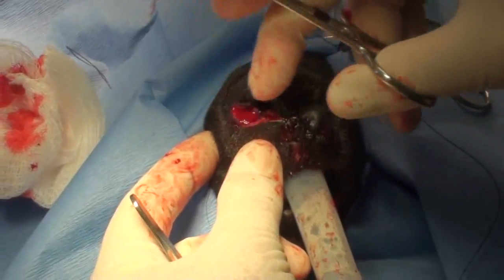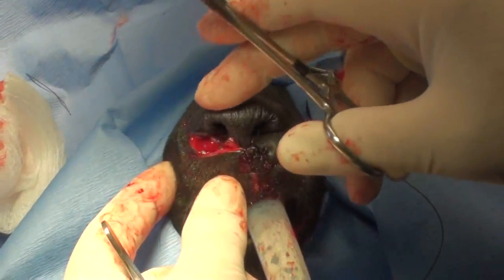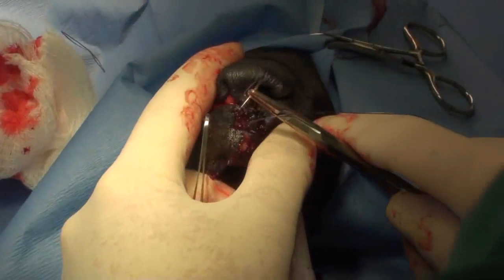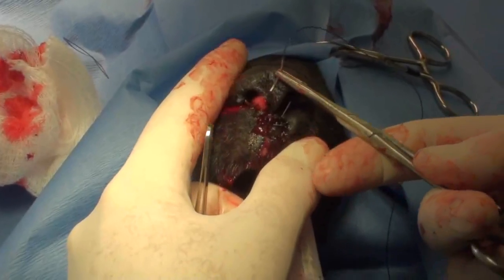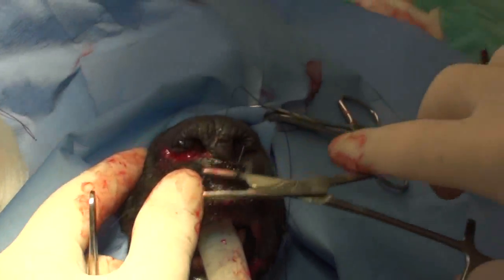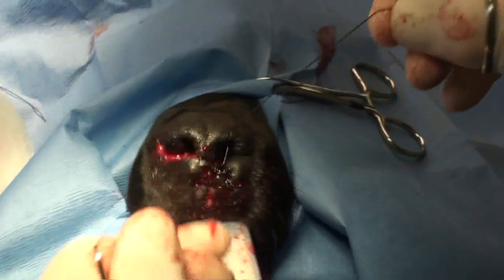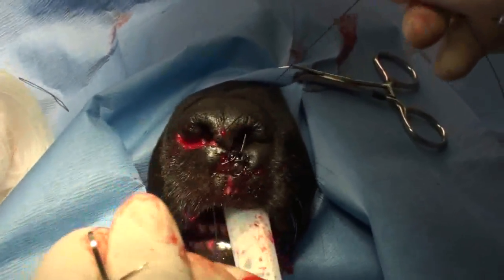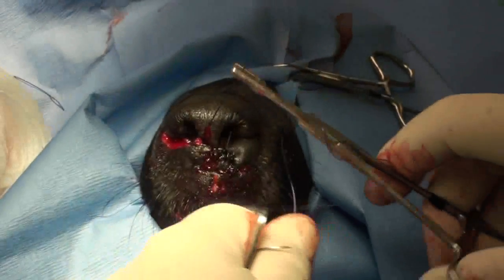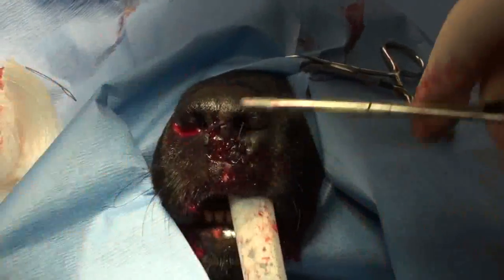I usually put sutures under the skin in wounds, but the nose is so tough. It's hard to get a sub-Q stitch deep enough to where it doesn't get in the way, so I just use skin sutures. Just like with the entropion, this dog has to not paw these out. Here it comes through the edge — this is tough skin. You can't pull this suture out. I mean, people think skin will just tear, but in this dog you'd have to really pull. So we're just not pulling too tight — we're just getting the tissues together.